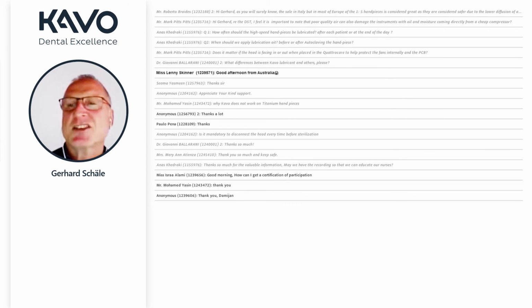Yes, this is a question regarding the aerosols. The aerosols right now are a very, very big topic we are faced with, and I agree with Roberto Breides for sure that when we compare turbines with the red ring instrument, it's a question of the speed, and when you have an instrument which is not speeding up that much, you create less aerosols. That's 100% for sure. Right now, for all of you, I can give you the information that we are working on a PDF file.